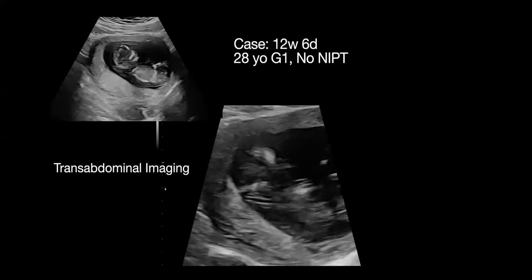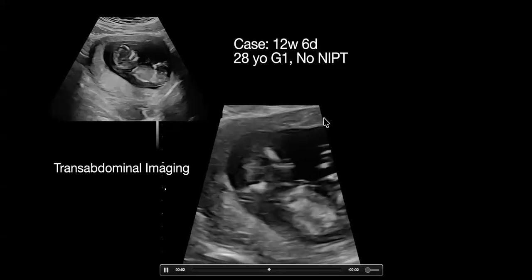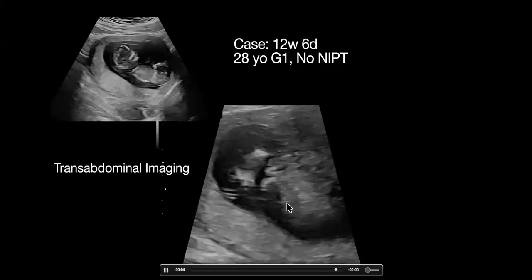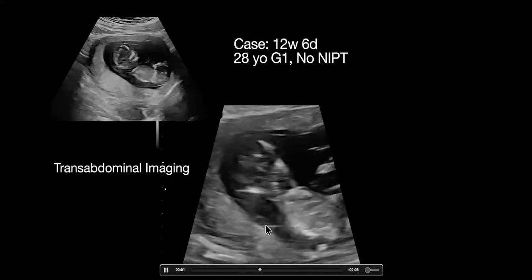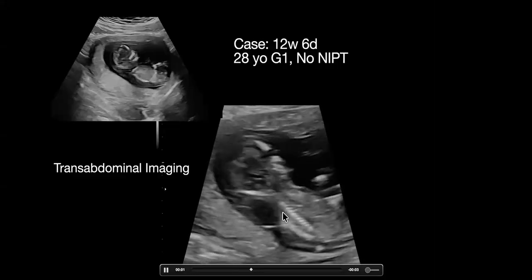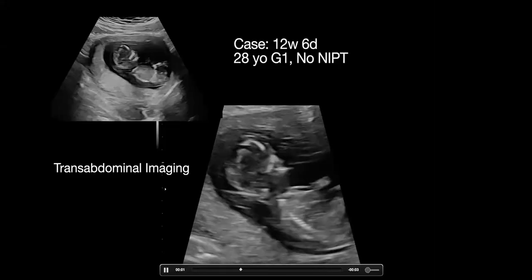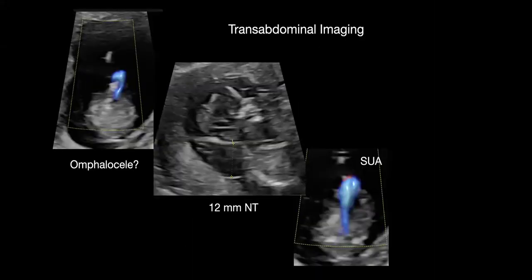This is how it looked, trans-abdominal imaging. Here, of course, you could measure the crown rump length, but one of the things you really want to try to assess is the back of the neck, to assess whether or not there's a decreased or increased nuchal translucency. But here you could actually see that it is increased. So that, first off, does not look good. And the sonographer did get a lot of images too.